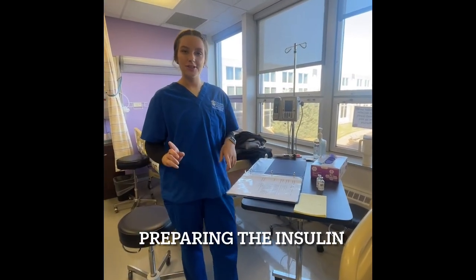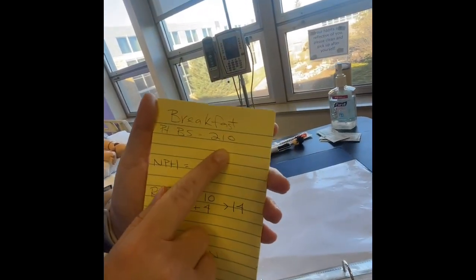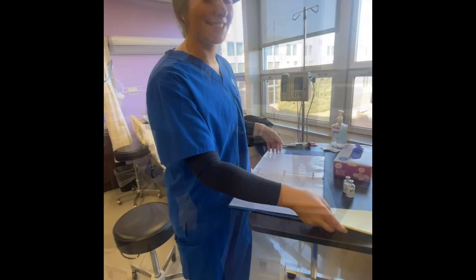And now we'll be getting into the skill. We'll be demonstrating how to draw up the insulin. First, read through the chart, looking at allergies, any pertinent history, medications, and medication logs, but this is what we're specifically looking for. In this scenario, it's breakfast time and the patient's blood sugar was 210, so he's going to get 20 units of NPH plus 10 units of regular, and on the sliding scale he's resistant, so at 210 he's going to get an additional 4 units. Now that we know our dose, let's get started.